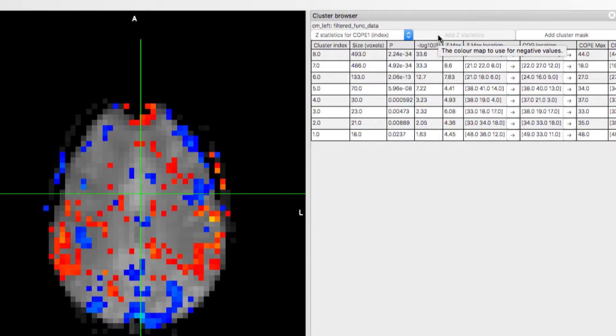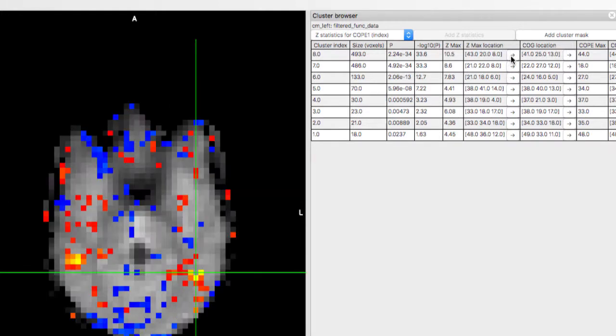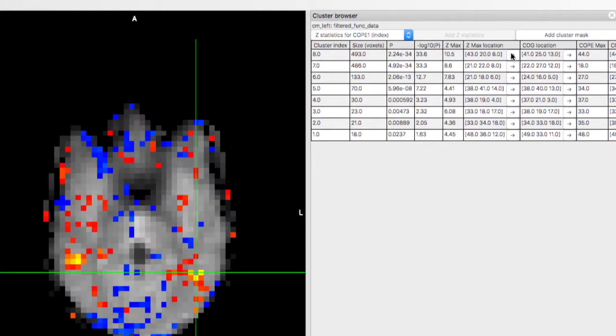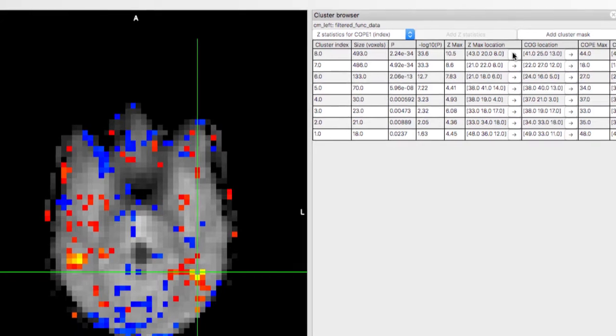If you click on the arrow button next to the Z max location, it will jump to the peak Z score voxel for that cluster. Now let's look at the model fit.